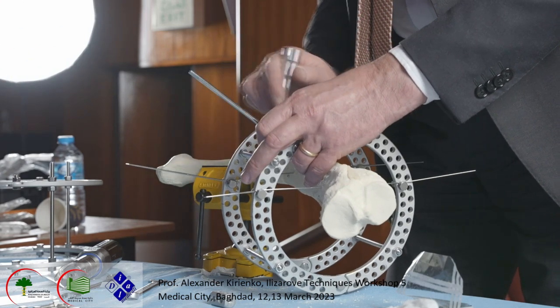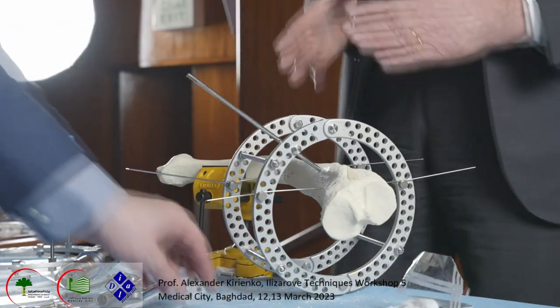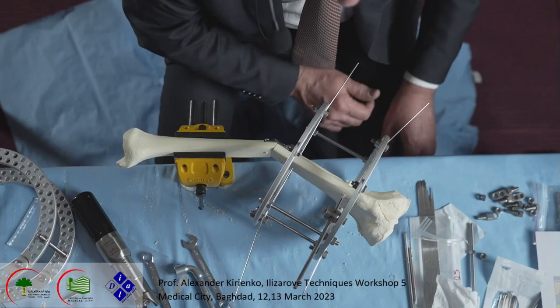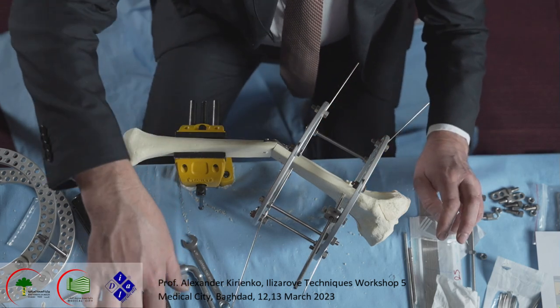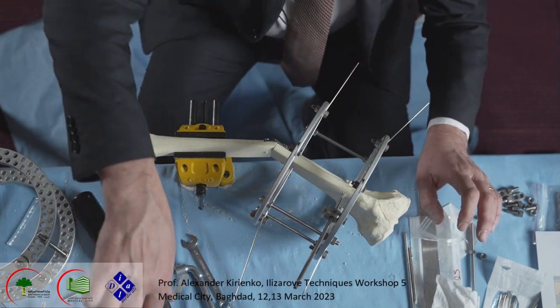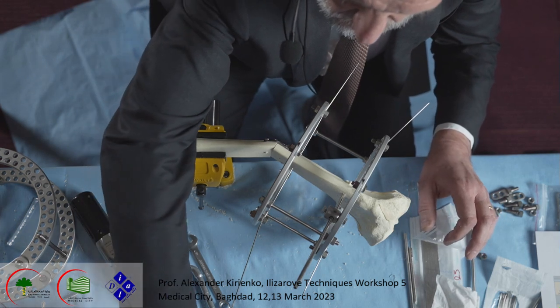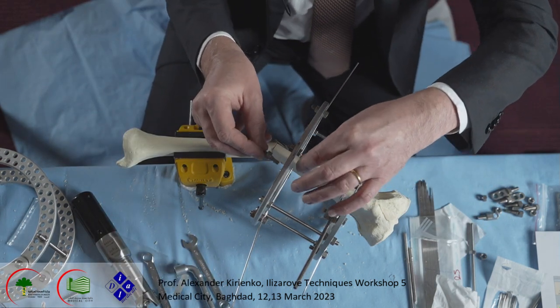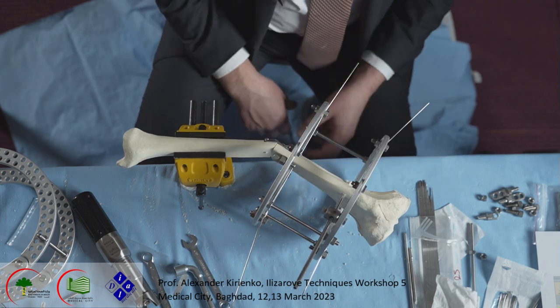Now, what we do, more important and interesting things, we create the hinges, because like I said, I want to show you step by step how we build the frame. Not pre-build it, but better if you do it slowly. If you want, you may do it with fluoroscopy, because we need to create the hinges exactly at the level of the fracture.